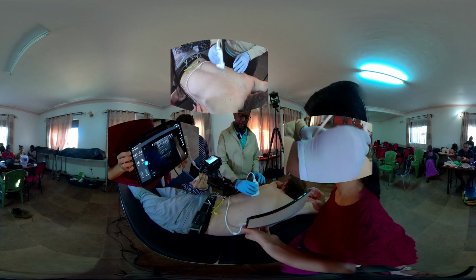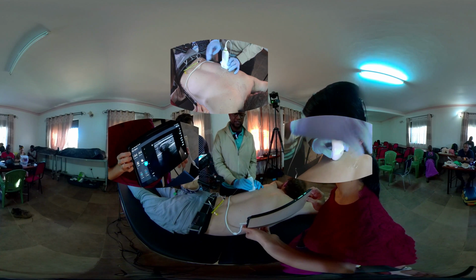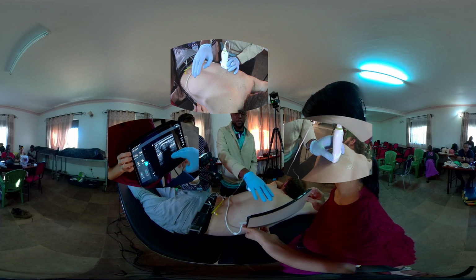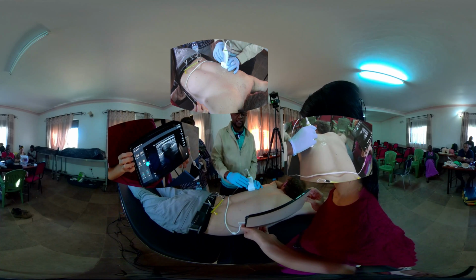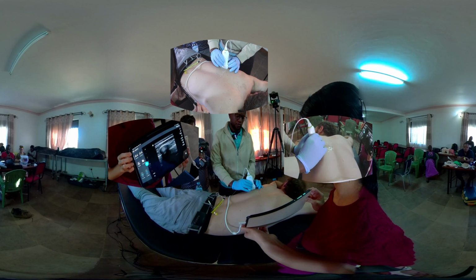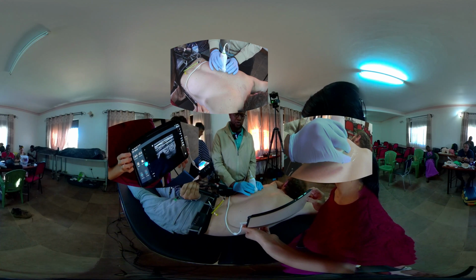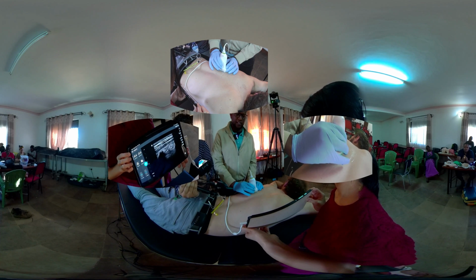So to scan, you start laterally looking for the ribs. The ribs appear as rounded structures as you see on the screen. They appear more rounded compared to the transverse processes, which look more straight, more flat at the upper surface. We'll see that as we scan medially. So from the lateral aspects, you scan towards the midline and wait for the rounded appearance of the ribs to become more flat.